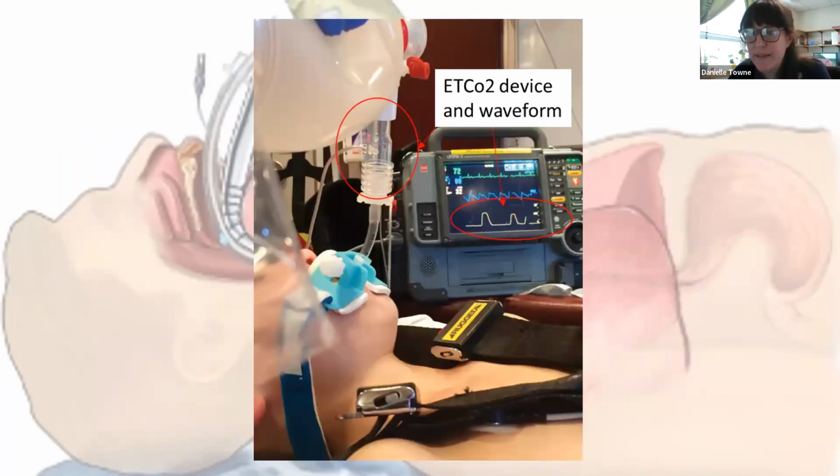All right, so you push your meds, your provider completed the intubation, they say the endotracheal tube is in. How do you know? Immediately after the provider removes the stylet or the bougie or whatever they had used, they inflate the pilot balloon and say, go ahead and bag the patient. There are a few things we need to do to confirm that placement.